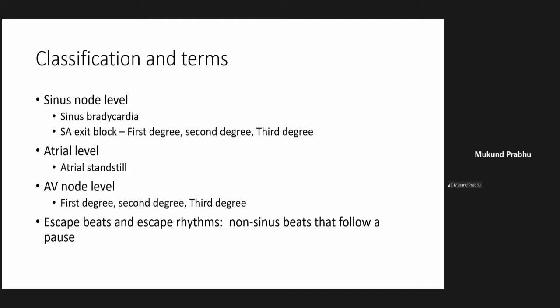Escape beats are actually non-sinus beats that follow a pause. Because the normal sinus beat didn't come, another focus has escaped. And when the escape beat sustains the heart rhythm, it's called an escape rhythm.